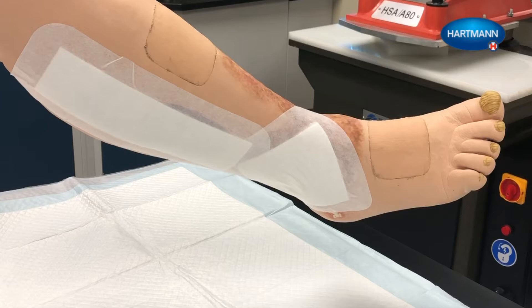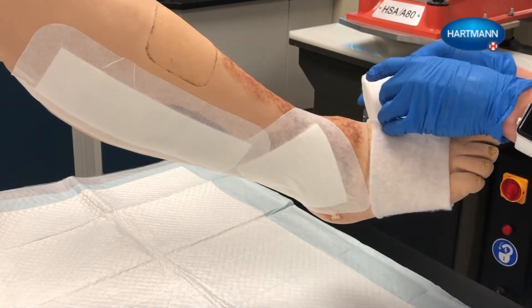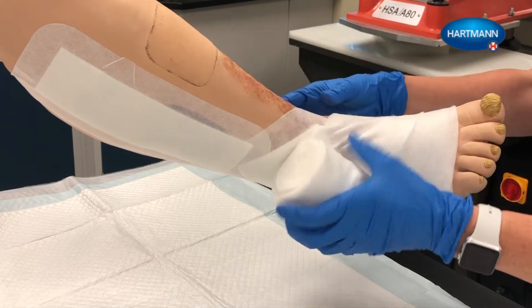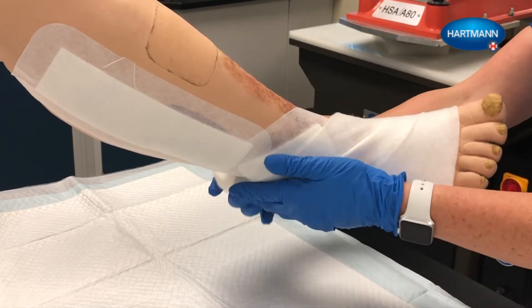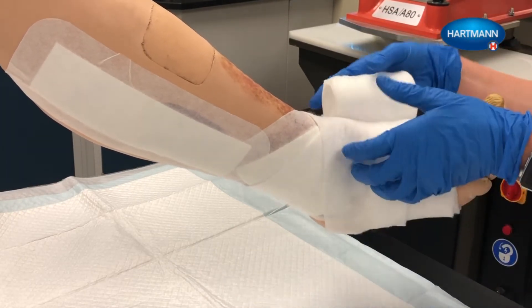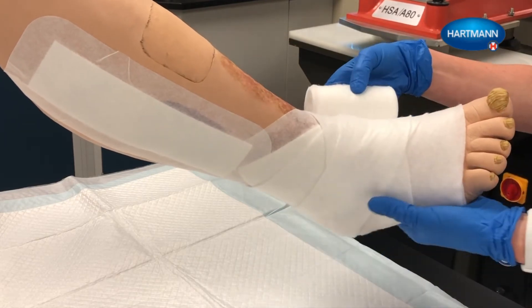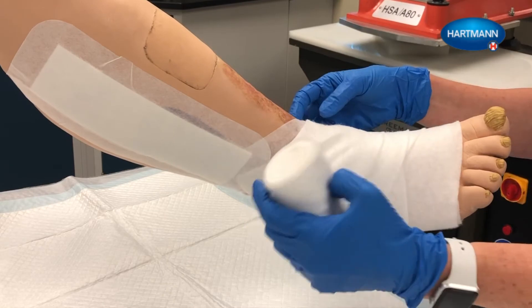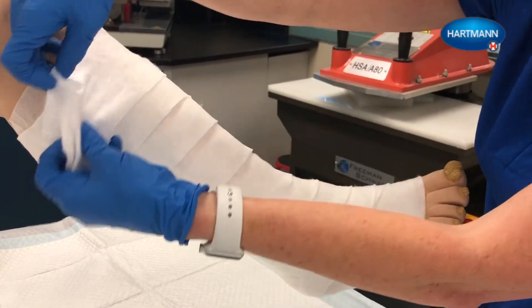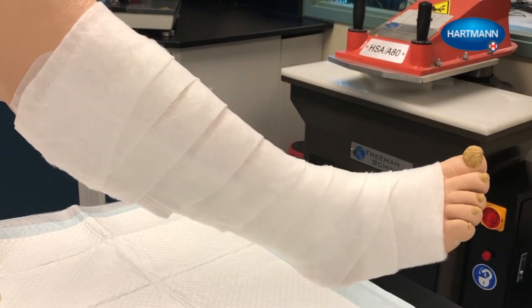Layer 1 is the padding bandage. Wrap the padding absorption layer with the fluffy cotton side against the skin. Start applying the bandage proximal to the base of the toes. After two turns for fixation, wrap the bandage across the back of the foot and then enclose the heel. Using a spiral technique with 50% overlap, continue to wrap the leg to just below the knee, smoothing the bandage after each turn. Cut off any excess bandage and use it to pad bony prominences such as the tibial crest — this is especially important when the leg is thin and bony.